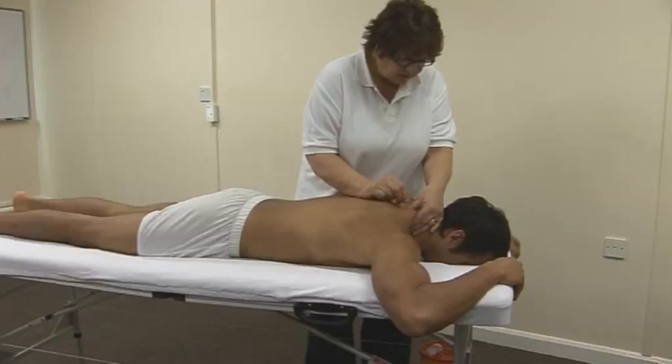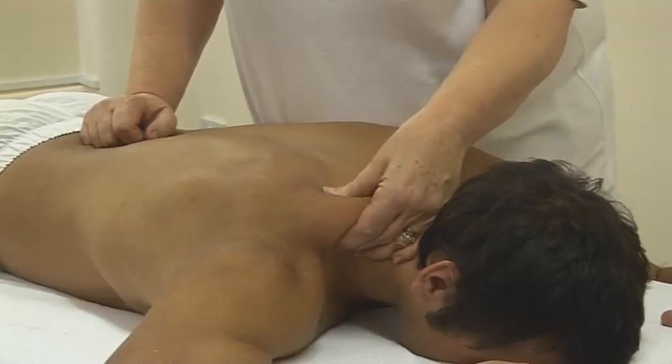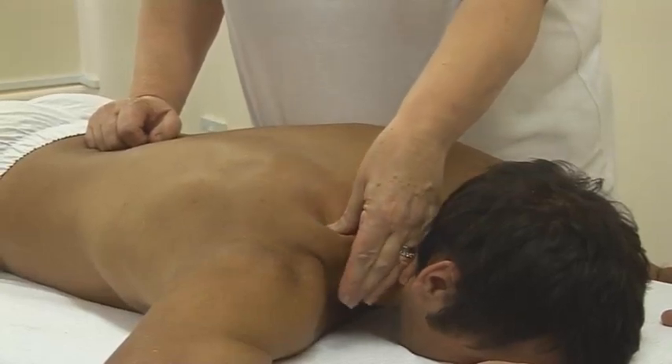Needling should be followed by palpation to check that the pain has eased. The practitioner returns to palpate, asking the patient what they feel. The patient responds: I feel nothing.